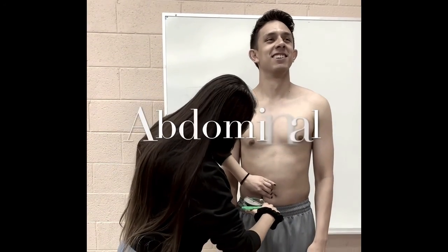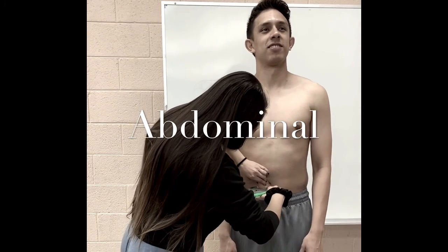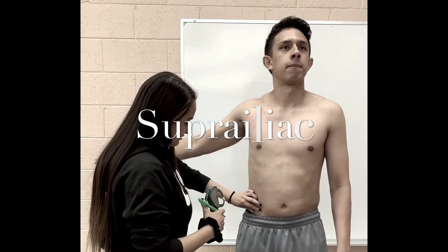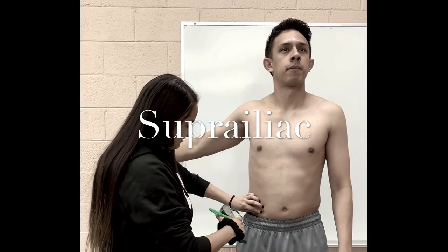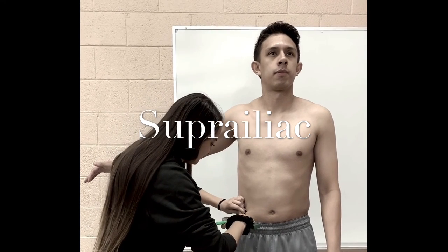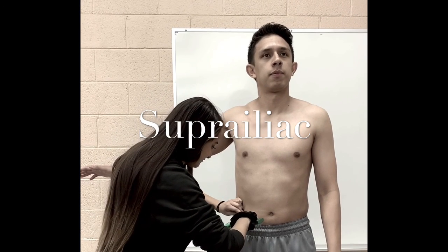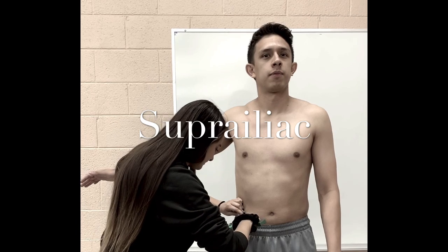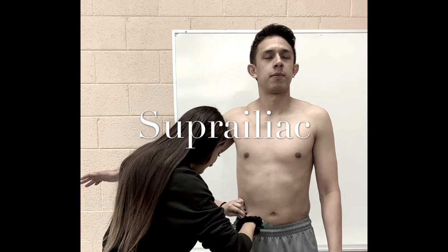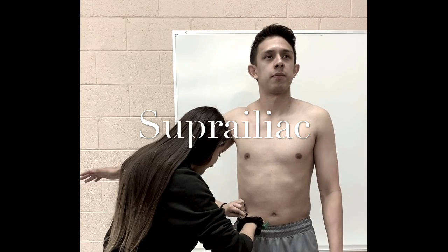The abdominal site is a vertical fold 2 centimeters to the right side of the umbilicus. The suprailiac is a diagonal fold in line with the natural angle of the iliac crest, taken in the anterior axillary line immediately superior to the iliac crest. You can have your client raise his right arm to the right side in order to have easier access.